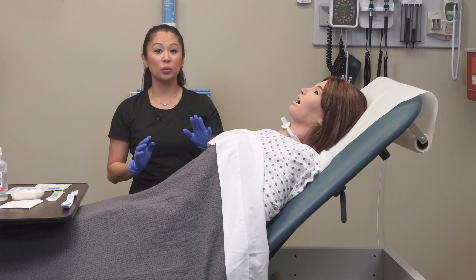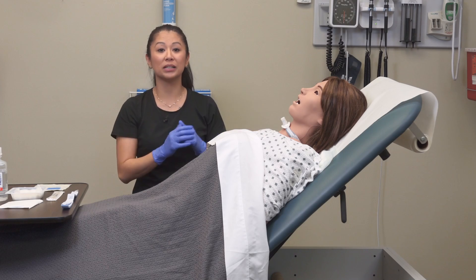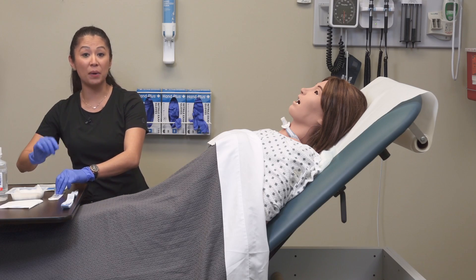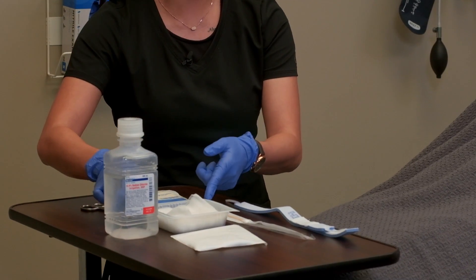With one hand, lift up the flange and use the other hand with moistened gauze to help clean the patient's neck. A good idea is to go ahead and open up your sterile cotton-tip applicators as well so that everything's open and ready for cleaning.